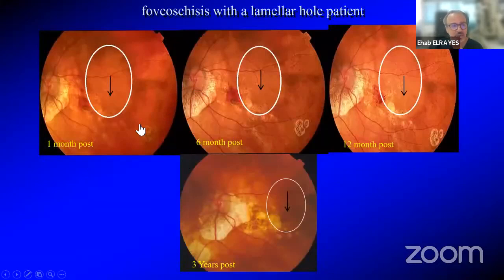And let's look at this patient here after creating a macular buckle. What is the normal progression of myopic changes like in this patient? This is the area that was buckled. Taken at 6 months, you can see that there, of course, there are also some myopic macular degeneration outside the buckle area. At 12 months, you can see that also there is progression outside. This is a site that patient had a CNV. Look at the progression of the myopic changes even outside the buckle area.